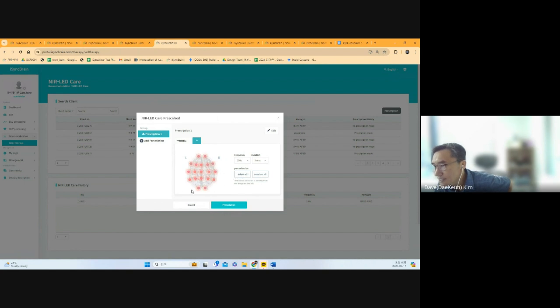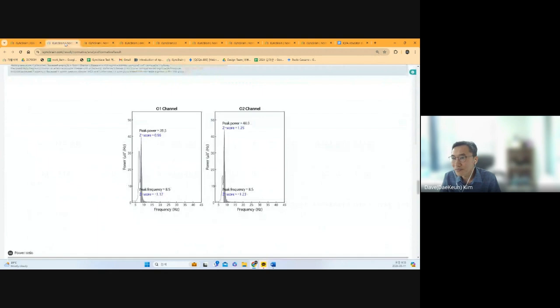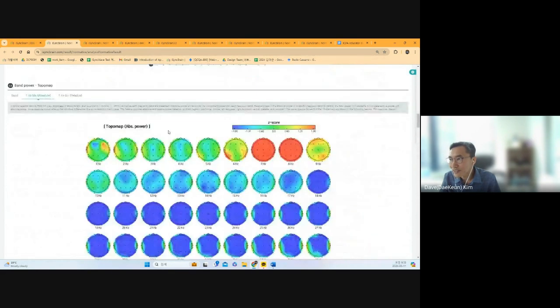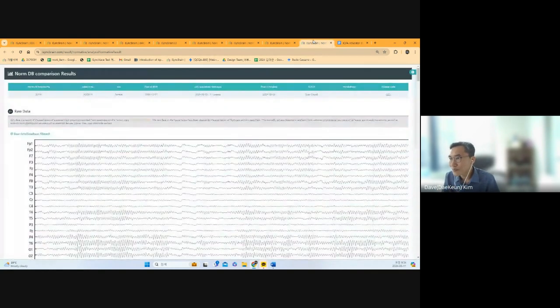stimulation like this, global 10 hertz stimulation, maybe a little bit. Her alpha frequency is currently 8.5, and 10 hertz shows the deficiency, so we can tune up all the brain oscillation to a more fast rhythm.